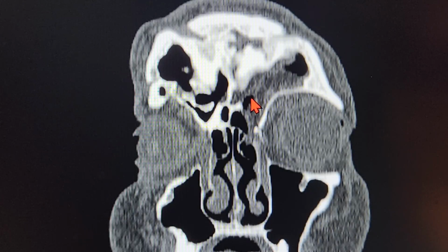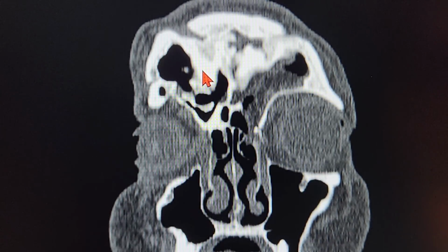It's completely occupied. There's a lot of bony ingrowth, and you can see abnormal bone growth towards the inner part of the frontal sinus. If you focus on the patient's right side, you can see a huge downward, inferior growing bony projection that has double density, different density shadows. Over here where my mouse is, there's a lot of hyperintense shadow, but towards the end of it there's a lot of gray collection along with some minute dispersed bony areas.